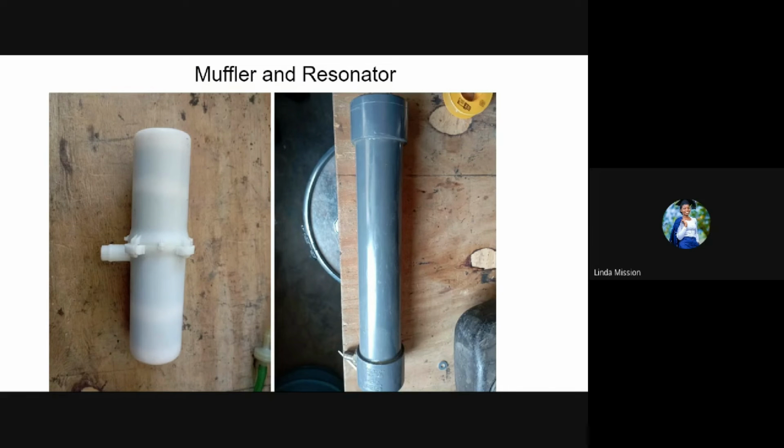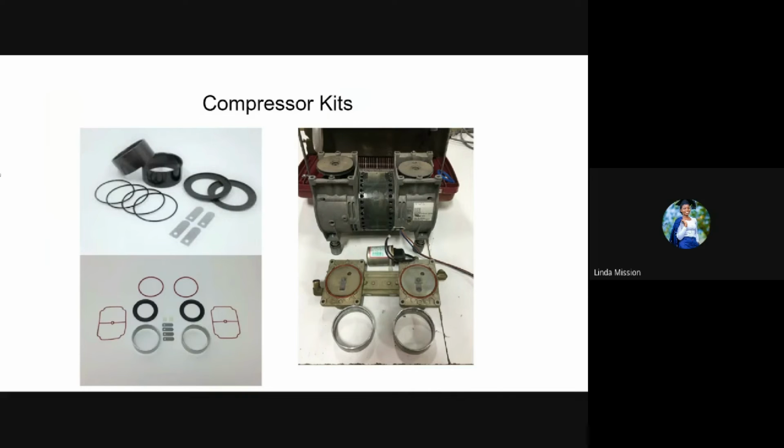And on the other hand, we have the exhaust muffler. Its function is to reduce noise of nitrogen-rich air which is discharged from the sieve beds in the concentrator to the environment. If these two mufflers are not available in the oxygen concentrator, or are not connected properly, or they are broken, then a loud noise will be produced by the oxygen concentrator. And also, worn out compressor service kits can also cause a rise in the noise in oxygen concentrators.